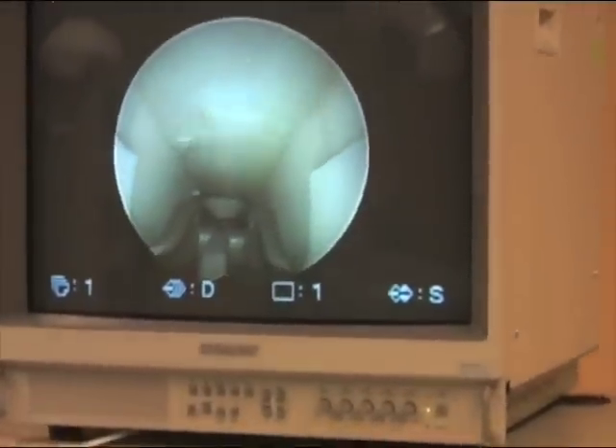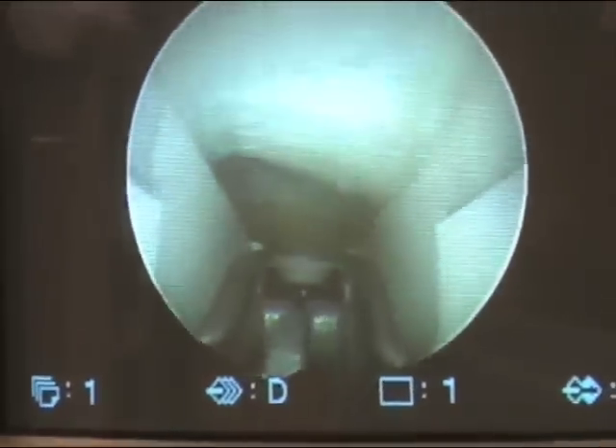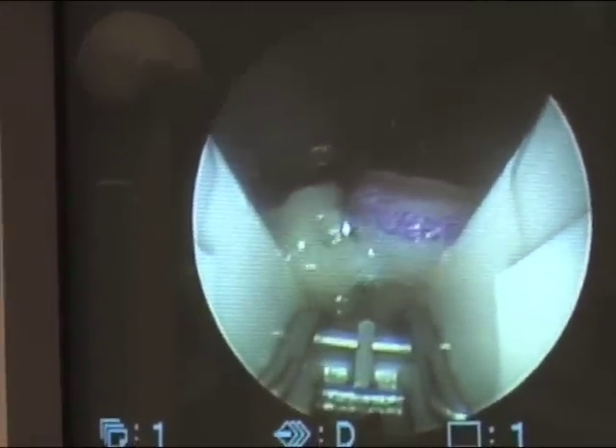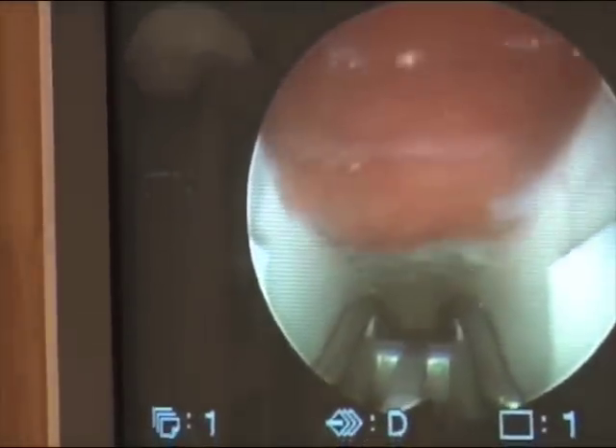It is then placed within the carpal canal, and as you can see on the video monitor, the transverse carpal ligament is identified clearly with fibers going across the screen. The blade is then elevated and the instrumentation withdrawn, providing an adequate release of the carpal tunnel. That pink structure above is muscle.